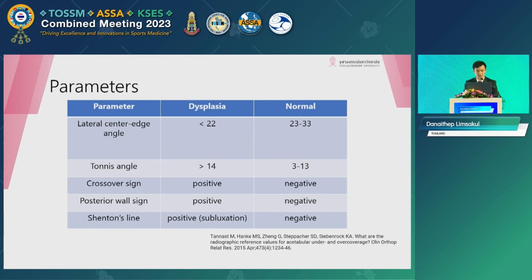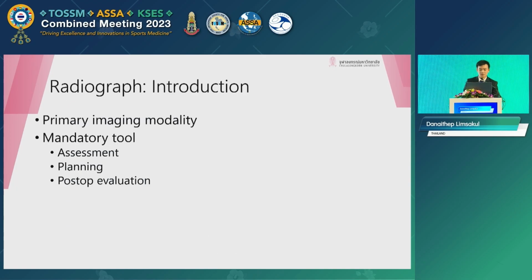Now let's look at the radiograph. We all know that the primary imaging modality is the radiograph, which we use every day, except for maybe today because we're in a meeting.